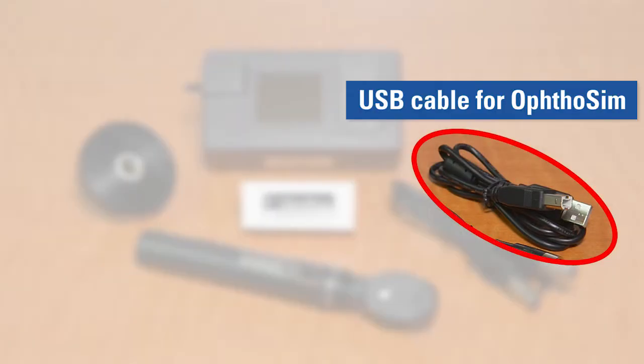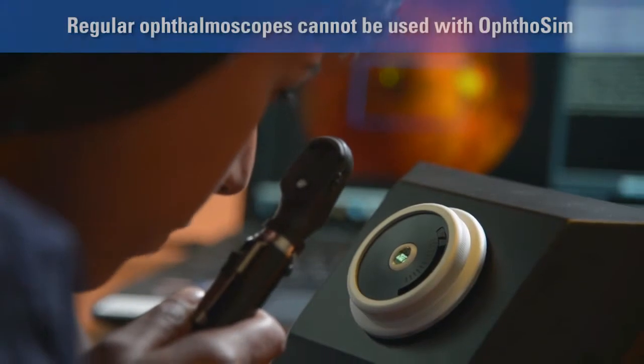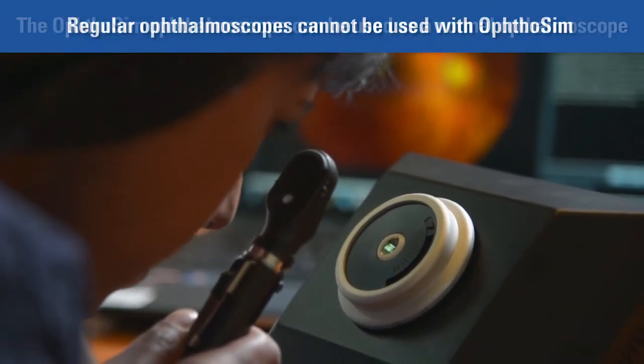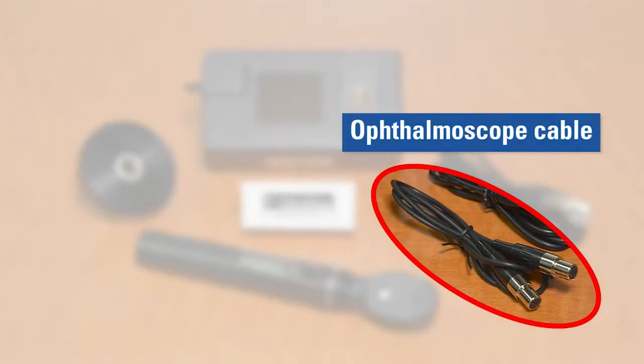USB cable for OphtoSim — this USB cable is different from the USB cable that connects the OphtoSim display unit to the computer. 3. OphtoSim ophthalmoscope — this ophthalmoscope has a built-in movement tracking mechanism. Please note that you cannot use any ophthalmoscope with OphtoSim, but the OphtoSim ophthalmoscope can work like a regular ophthalmoscope. 4. Ophthalmoscope cable — this connects the ophthalmoscope to the sensor box.